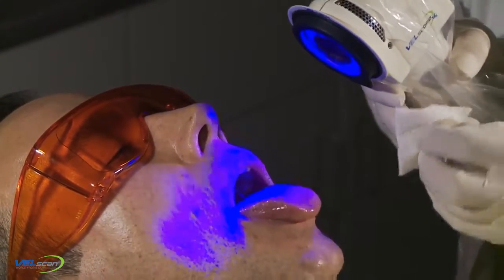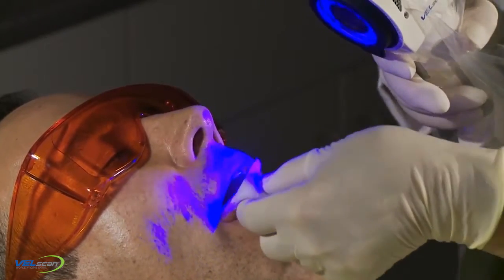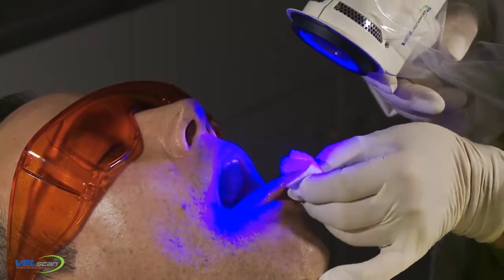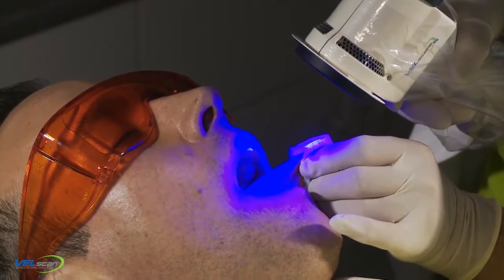Abnormal mucosa can be caused by a wide spectrum of conditions. Just the same, it is much better to err on the side of caution and sample suspect tissue than to ignore a potential disease process that could lead to oral cancer or another serious condition.